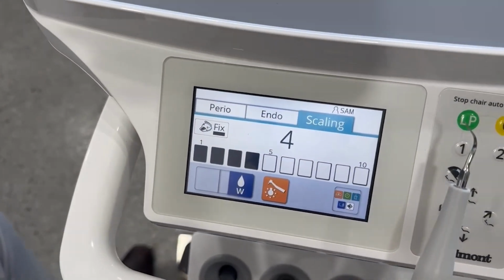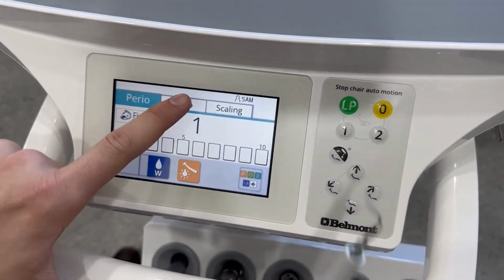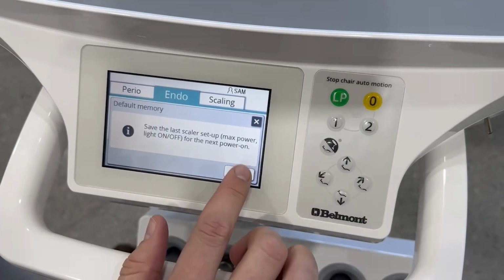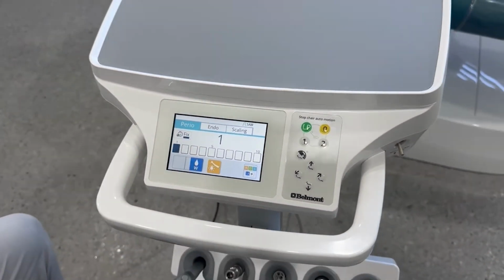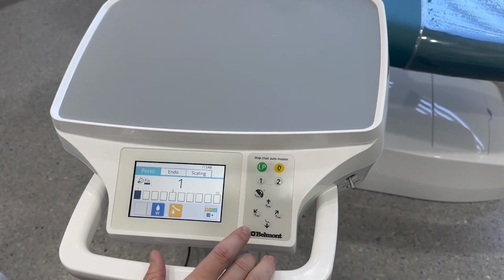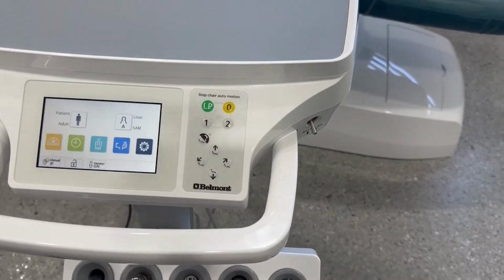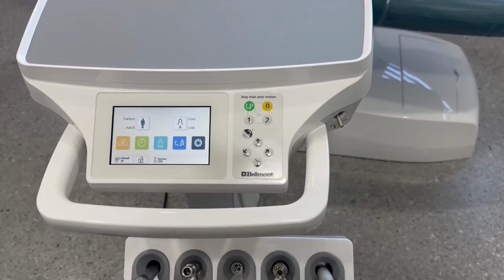So you see we've got perio mode, endo mode and scaling in there. And then of course we've got our settings, so we can go down the bottom there and hit save and lock in that setting. It's going to hold that setting until you change it, as our default setting. So that's our scaler control, all fairly straightforward. Water on, water off, power intensity on the screen there.